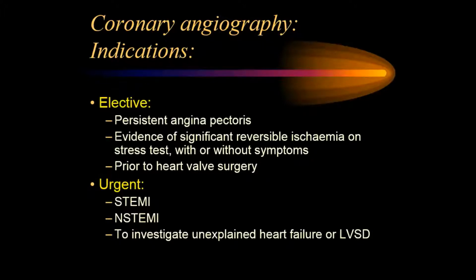And of course, there are urgent indications like ST elevation myocardial infarction. This is an extreme emergency, and non-ST elevation myocardial infarction, and in the midst of investigating some unexplained heart failure or left ventricular dysfunction, that could be a semi-urgent indication for it. So these are mostly the indications. There are some other indications, of course, but as I say, this talk doesn't cover everything. It just covers the basics.